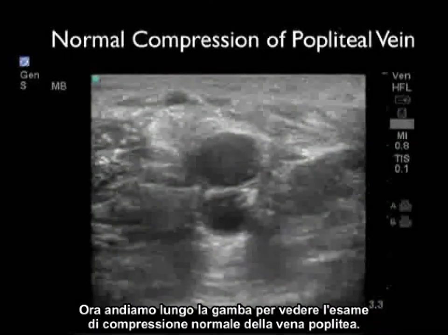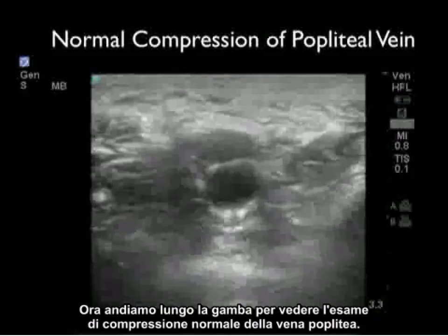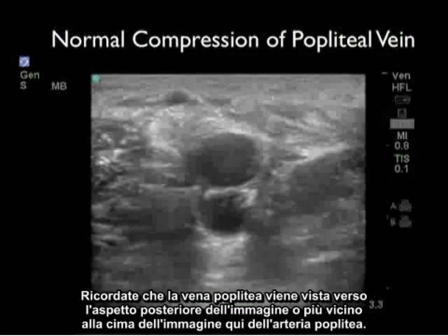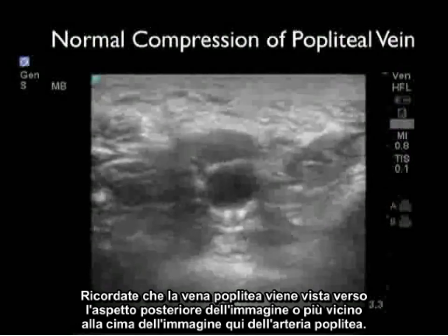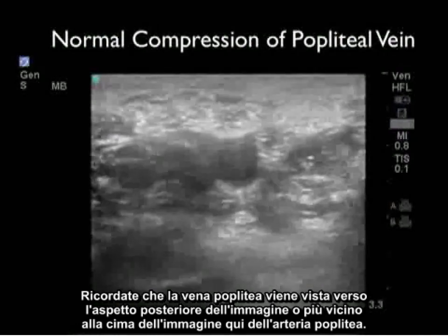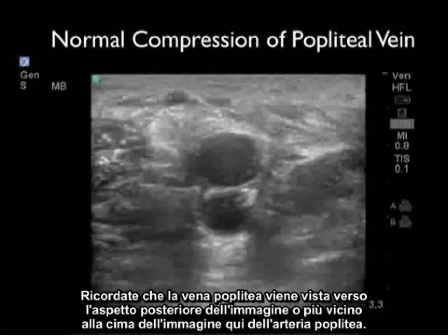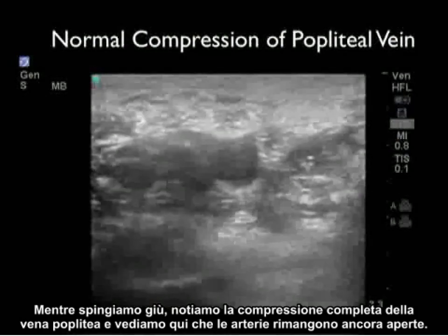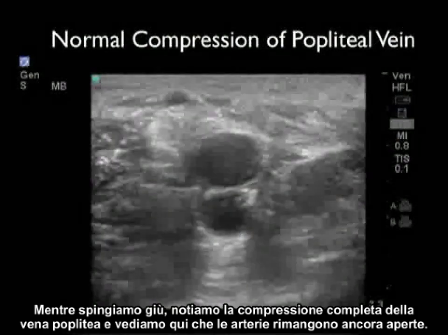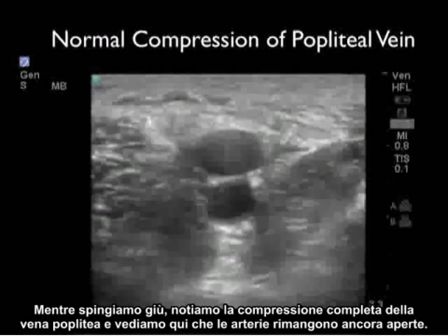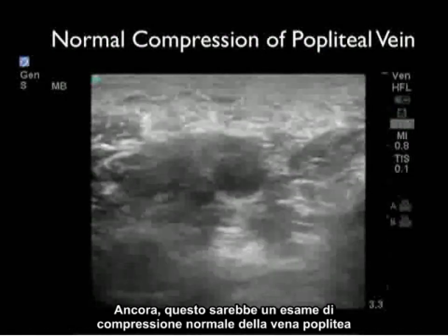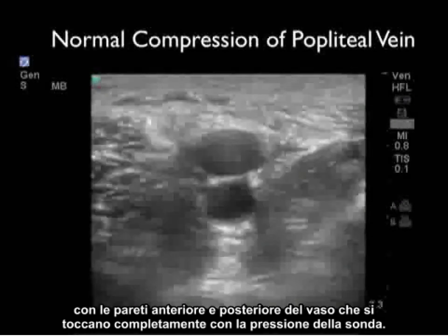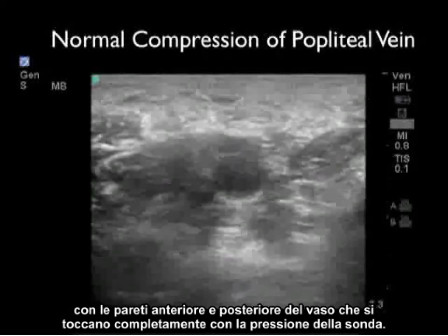Now let's move down the leg to look at the normal compression exam of the popliteal vein. Recall that the popliteal vein is going to be seen towards the posterior aspect of the image, or closer to the top of the image, than the popliteal artery. As we press down, we see complete compression of the popliteal vein while the artery stays open — a normal compression exam of the popliteal vein with the anterior and posterior walls completely touching down with probe pressure.